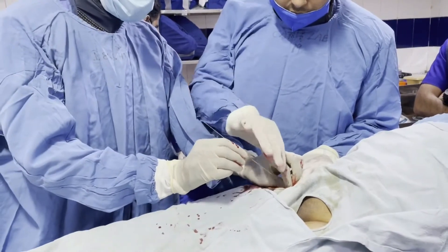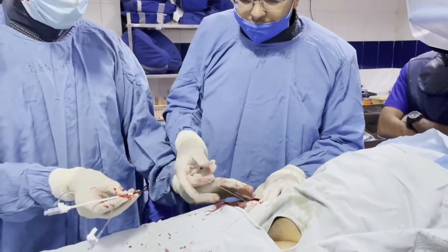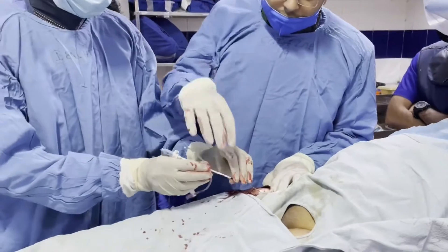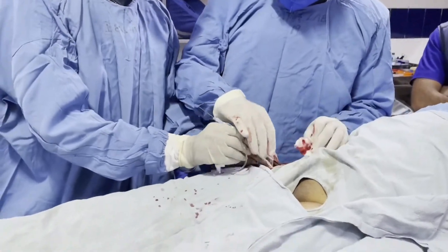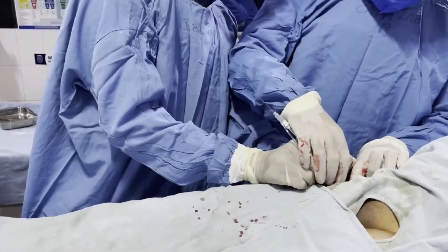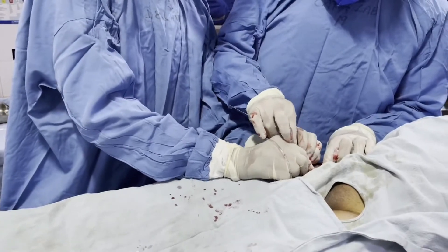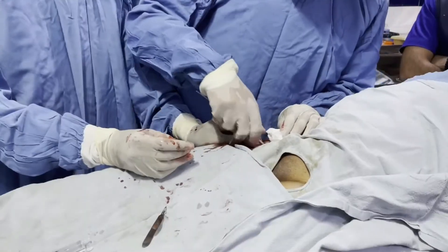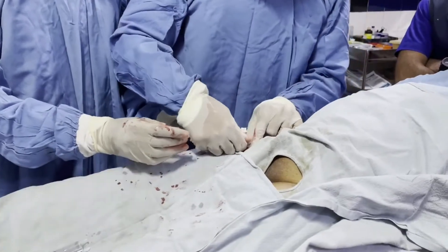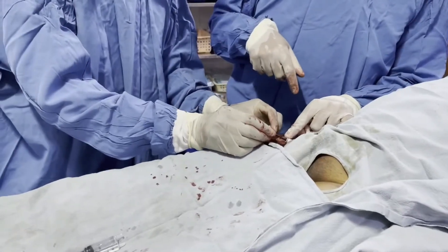The femoral sheath is a bit larger, so we have to make a small incision. Some interventionalists do not prefer using a scalpel cut, but preferably we should make a cut and then insert the catheter sheath through the guide wire. The catheter sheath has a dilator within it, so we remove the guide wire along with the dilator.